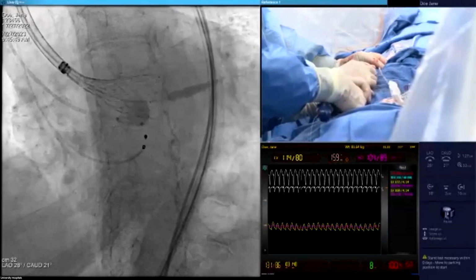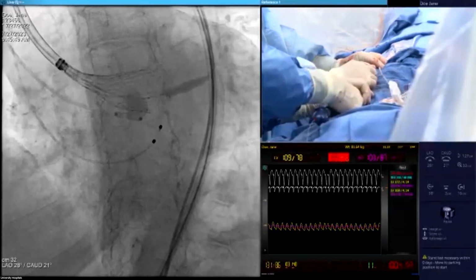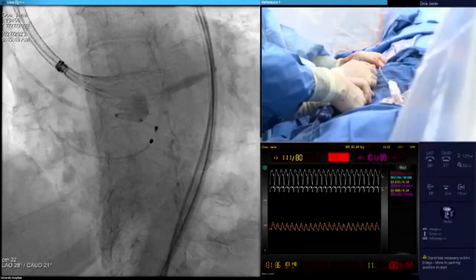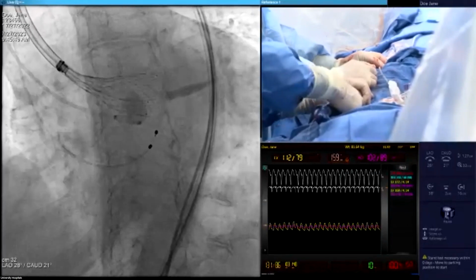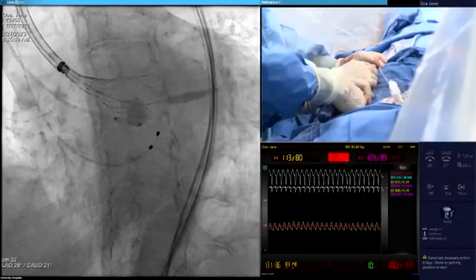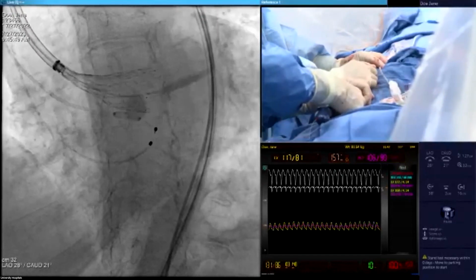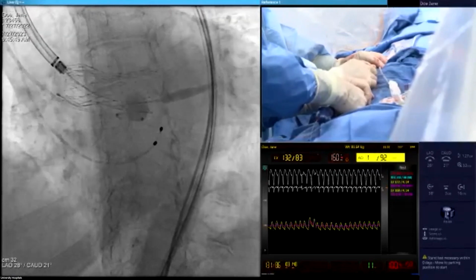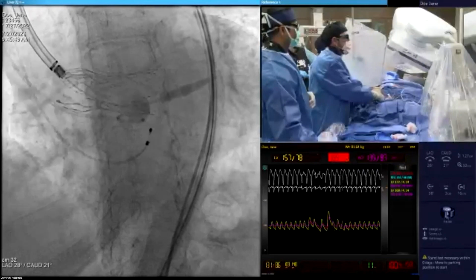At this point, I see that some people tend to wait for 5 or 10 minutes with the valve connected to the catheter. I'm going to say this: it makes no sense to do that. What makes sense, however, is a very, very slow deployment like we're doing, because remember, there's a lot of tortuosity here, and there is tension in the system.